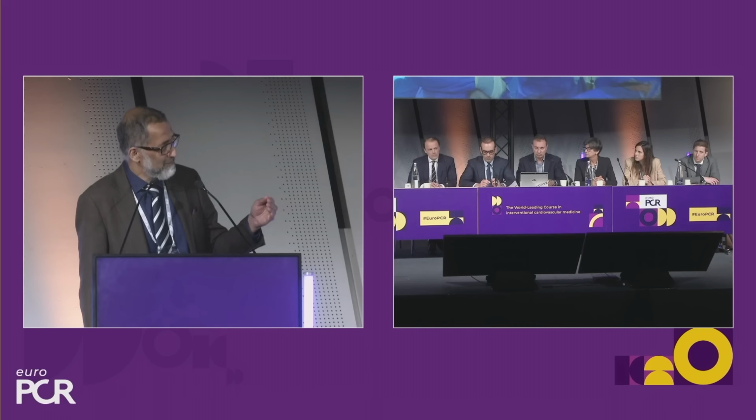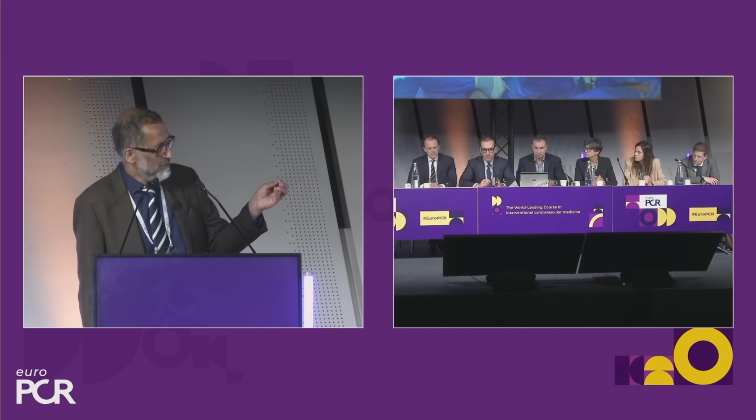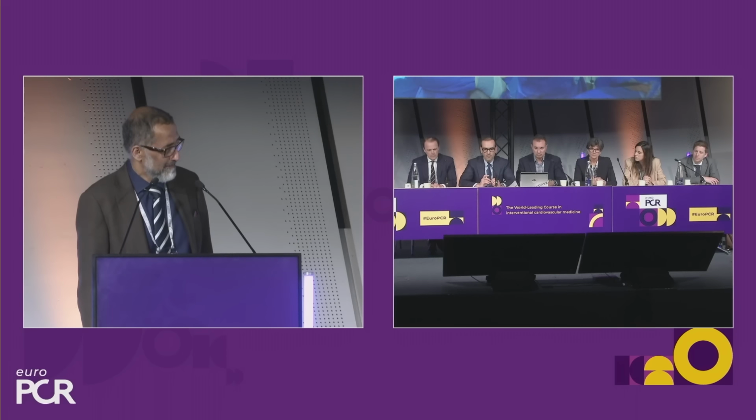The first one slipped down a tiny bit, but as you saw, the hemodynamics weren't catastrophic. I've just partially recaptured and we redeployed using the calcium actually that was at the bottom of the leaflet as the marker. So if you looked at the pigtail, it might look slightly low, but if you looked at the calcium, it's pretty reasonable deployment.